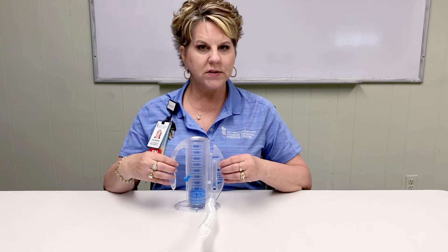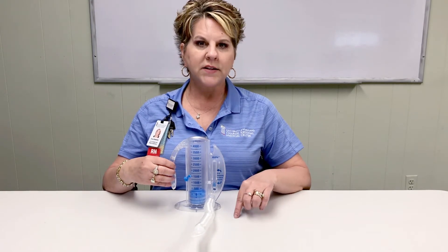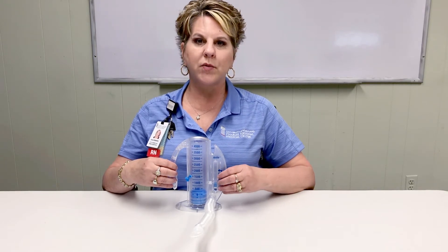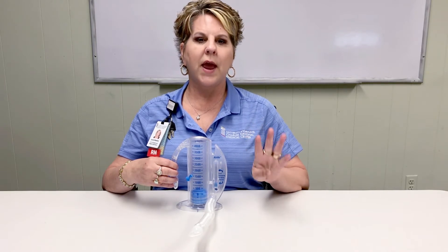You will use the incentive spirometer 4 times a day in the hospital and once you are discharged home. An easy tip to remember: 4 times a day — after breakfast, after lunch, after dinner, and at bedtime.